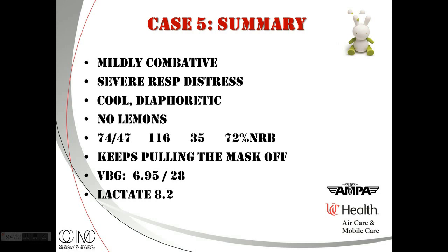So at this point in time, I'm going to go ahead and work on getting this gentleman on the ventilator on non-invasive positive pressure ventilation. And because I know that I'm going to want to switch it during the apneic period, once we do RSI, to a rate, I'm going to go ahead and do that BiPAP essentially by SIMV at a rate of 0. Alright, meanwhile, we need to work on his hemodynamics, because they kind of suck and they're about to suck more once we add positive pressure ventilation.